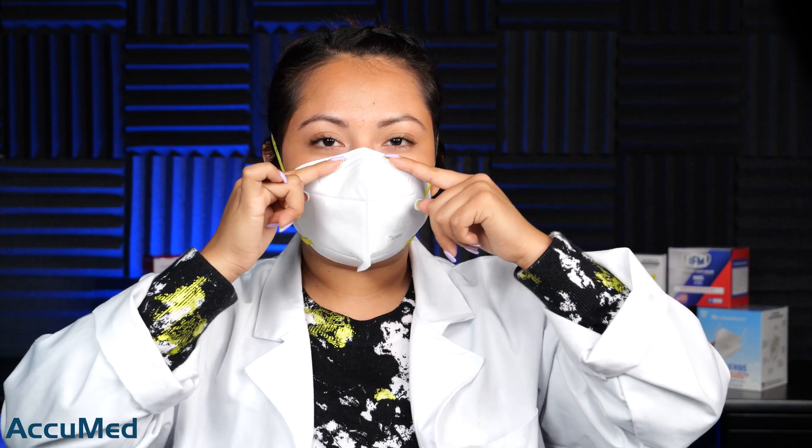Let's go ahead and put it on. The first thing I'll point out — and this really caught me off guard — it has a very strong smell, like a latex plastic smell. The nose wire is a bit on the weaker side, but we're going to try to adjust it to my nose bridge. This also has that sort of itchy material around the face mask. The lower headband is a bit on the looser side for me. It has a little bit of collapse, but nothing too crazy.